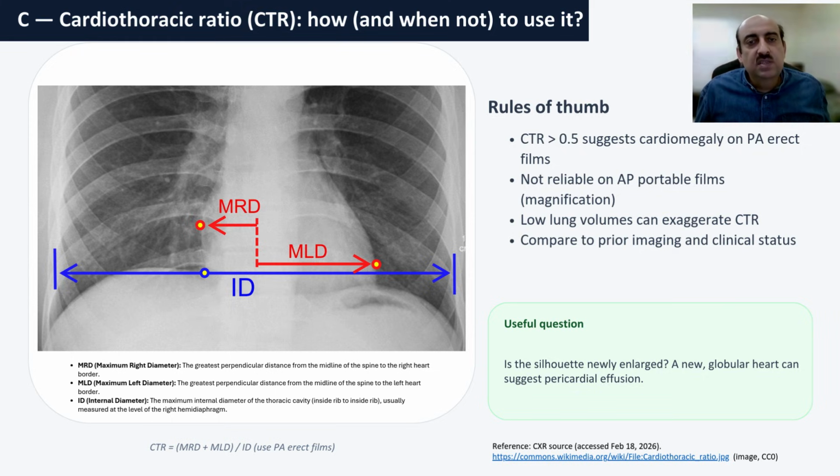If you look at the chest x-ray, a PA film, it should be nice, central, not rotated, not tilted. The right ventricle is higher up and the left ventricle's maximum edge is lower down, so you can't compare it side to side in the same line. So think of a midline, which passes through the center of the spine and the cardiac shadow. That is your reference point.